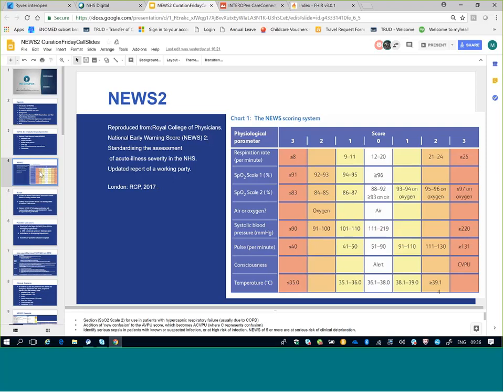There are other changes in the tooling, which include the way colors are shown, which are quite visual, and the order of all the parameters. I would recommend you look at the RCP report. What I'm highlighting is what we found was relevant to our design in FHIR. So these are the key changes we had to take into account while designing.